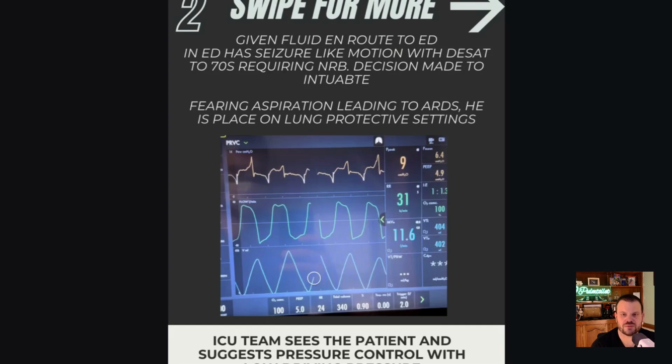So if you're going to intubate the patient, our post-intubation settings are going to have to be similar to what the patient's doing during the pre-intubation period. If the patient's breathing heavily, aggressively because they have acidosis, you're not going to know that out of the gate because you only have a certain amount of history and information. But certainly with the sugar over 600 in the story, you would think that maybe DKA is playing a role. So you would need to think about your settings after you intubate the patient.